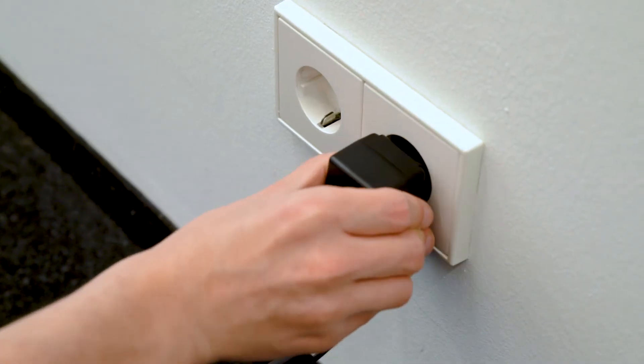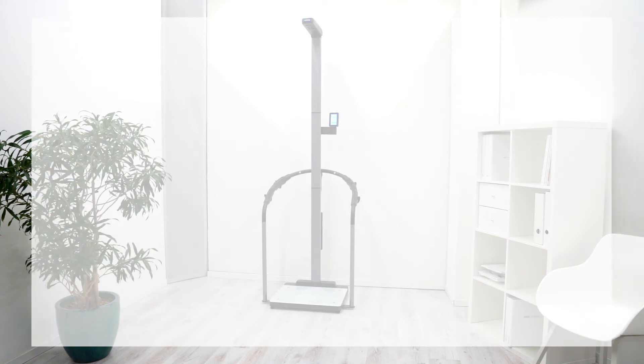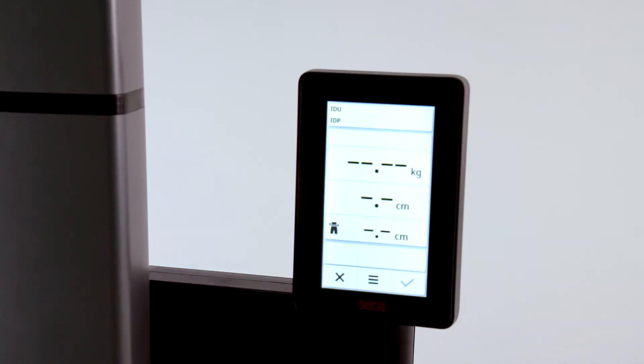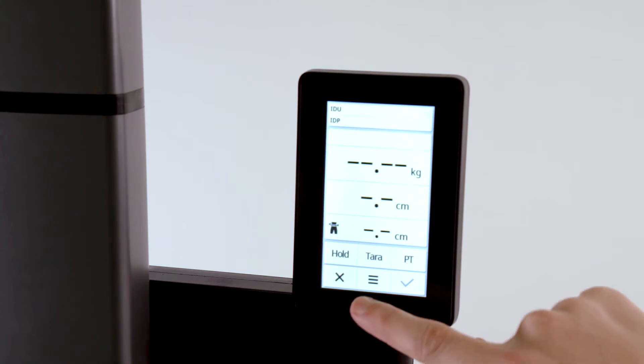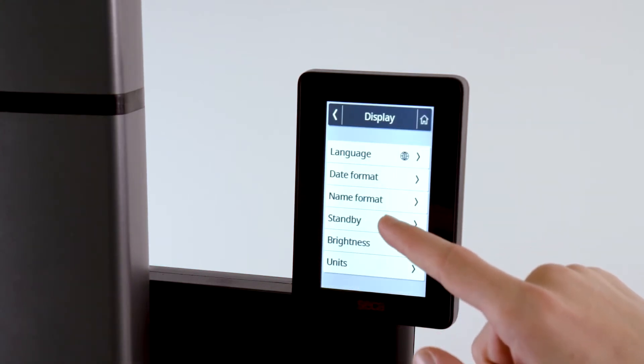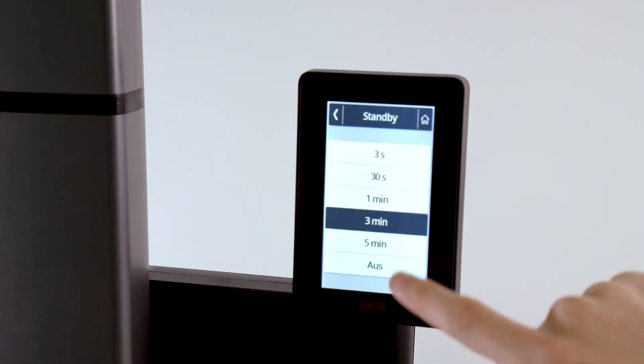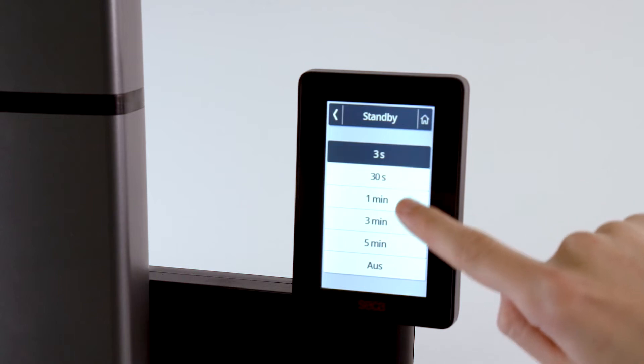Now, route the power cord. The power plug should not be plugged into a power strip, but into an individual power socket. Since the device does not have an on-off switch, it is switched on as soon as it is plugged in. If not in use, the standby mode activates after the time period you specified in the menu.